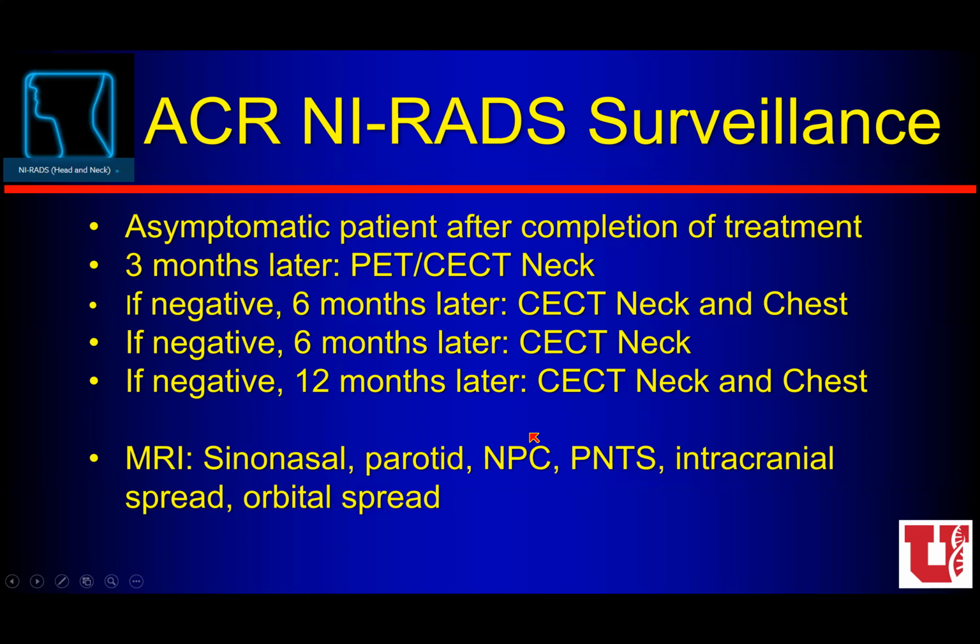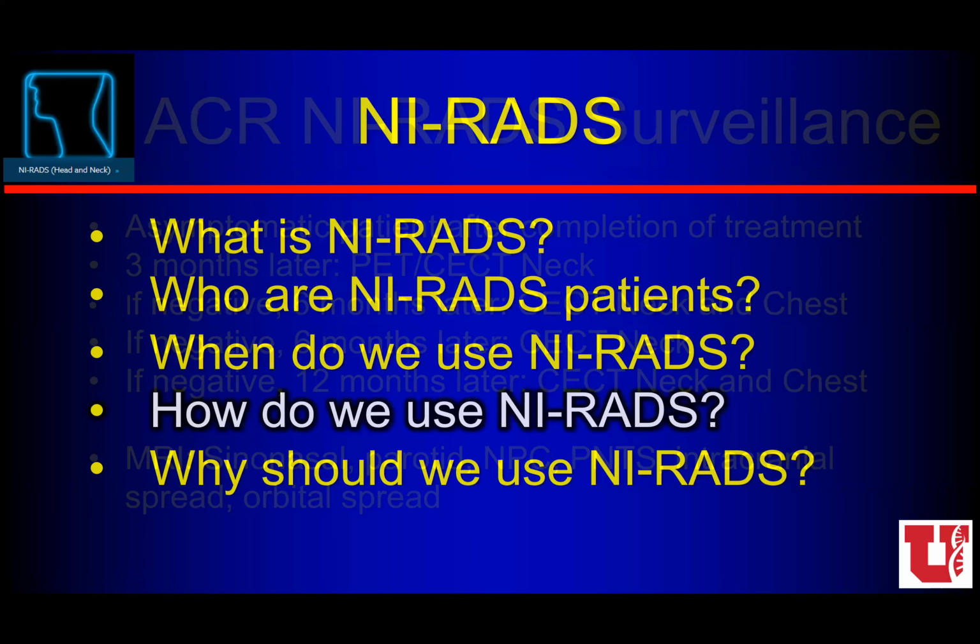So again, this is kind of a limited population. If it's only squamous cell carcinoma patients, only patients who have completed therapy, and only patients who have a PET CT, because not everybody's got a PET CT scanner that they're religiously doing their follow-up. But if you're not familiar with workup of head and neck cancer post-therapy patients, this is a good baseline system to work, especially if you're not at a big cancer hospital where you may have different therapies and trials that are going on with your patients.